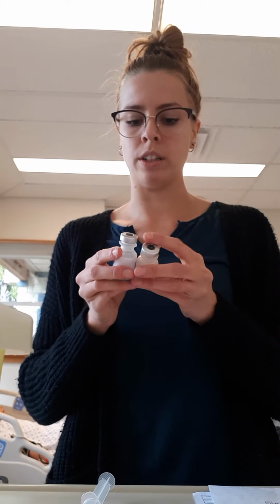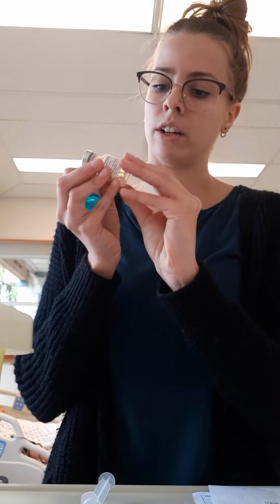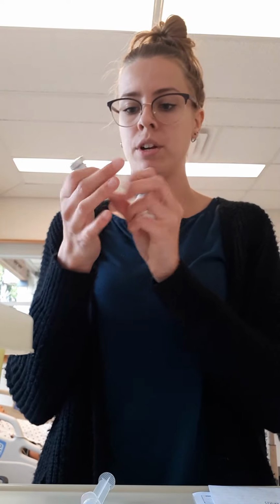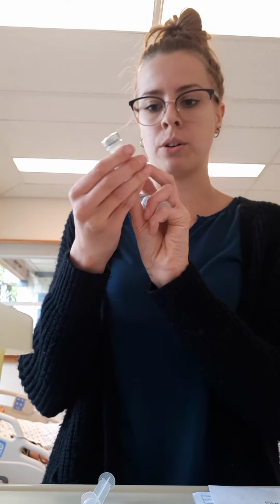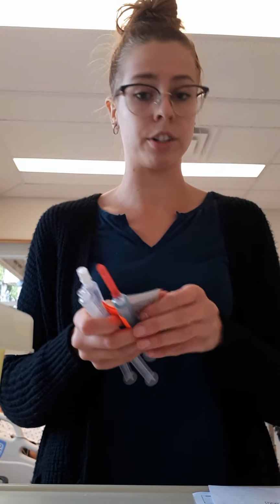So I've done that, and then I'm going to do my third check before putting these away, that this is indeed still sodium chloride, and it has not expired. It's good till 2023, and that this is naloxone, 0.4 milligrams per mil, and it still has not expired. It's good till 2035. I'm going to put those away. I'm going to bring my sterile swabs, my 2 posi flushes, and my MAR to the bedside.